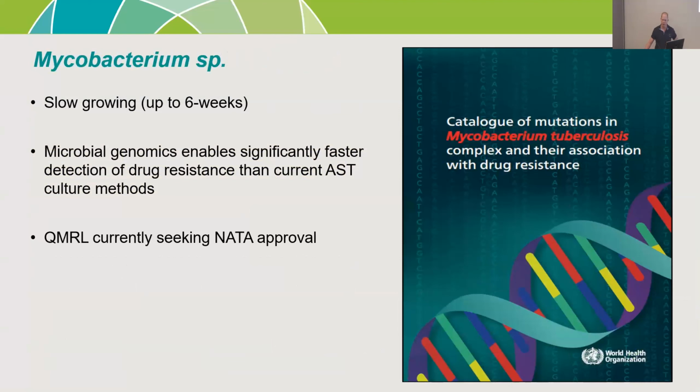So moving on to the MRL. We have the Queensland Mycobacterial Laboratory that's co-located with our lab. Clearly, genomics has been a major application for mycobacterial diagnostic delivery in recent years, such that the WHO now has a catalogue of drug resistance causing mutations that they publish every year. As I mentioned before, these organisms, particularly tuberculosis, are very, very slow to grow. So often it takes up to 6 weeks to get a primary culture, and then using the traditional AST methodologies can take you another 6 weeks to get a result.